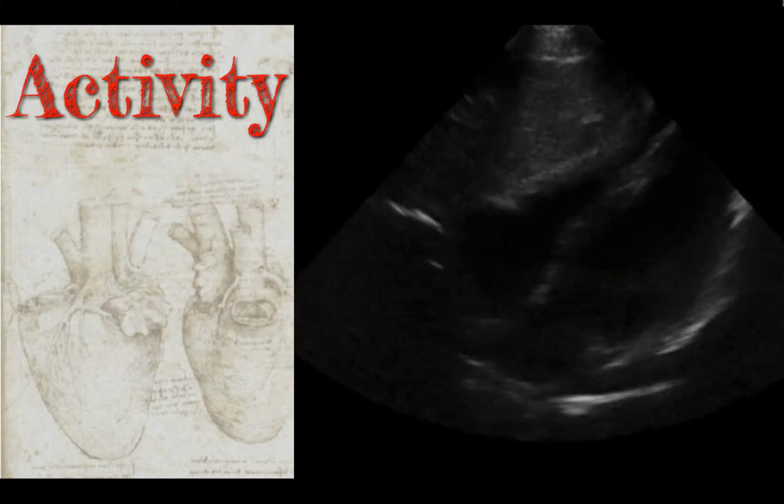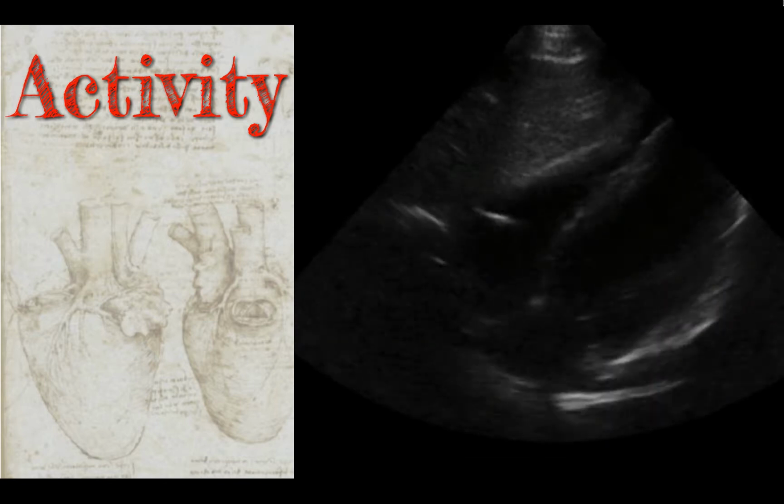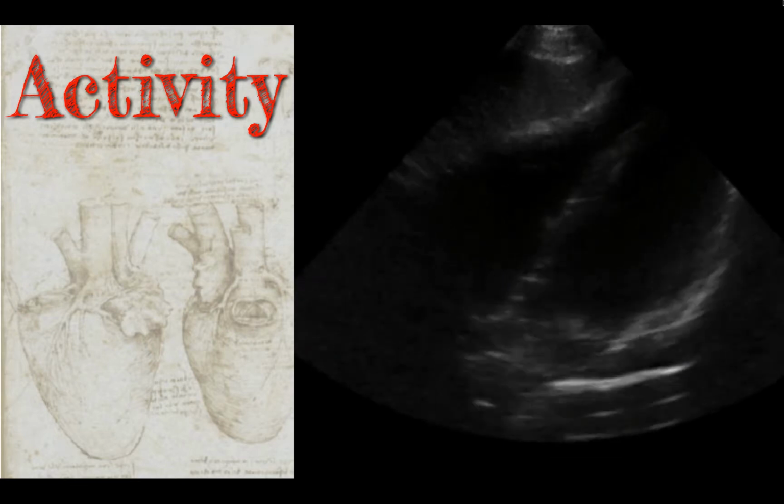Let's start by defining cardiac activity. This has long been a focus of debate because it used to be defined the way Judge Stewart defined pornography. Oh, you'll know it when you see it.